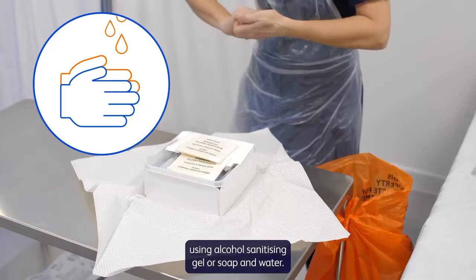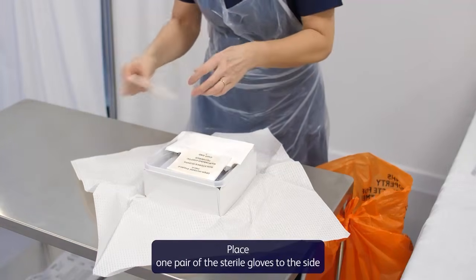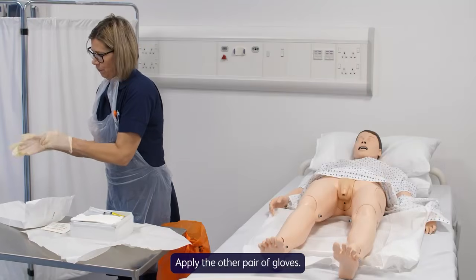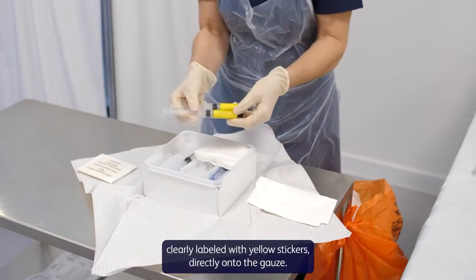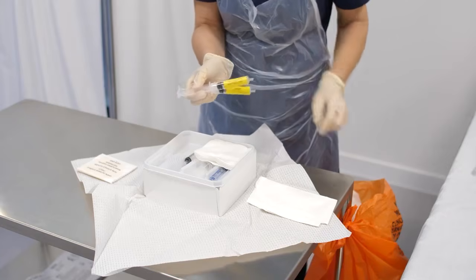Clean your hands using alcohol sanitizing gel or soap and water. Place one pair of the sterile gloves to the side to be used for inserting the catheter. Apply the other pair of gloves. Prepare your gauze for cleaning by applying the sterile water clearly labelled with yellow stickers directly onto the gauze.